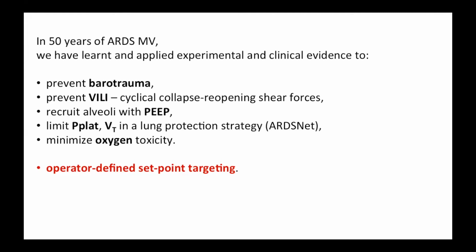They've enabled us to recruit alveoli using PEEP, to limit the plateau pressures and tidal volume in a lung protection strategy from about 20 years ago, and also to minimize oxygen toxicity.